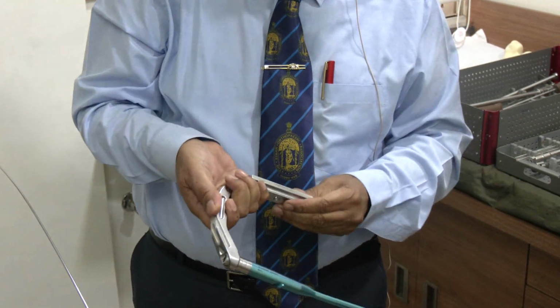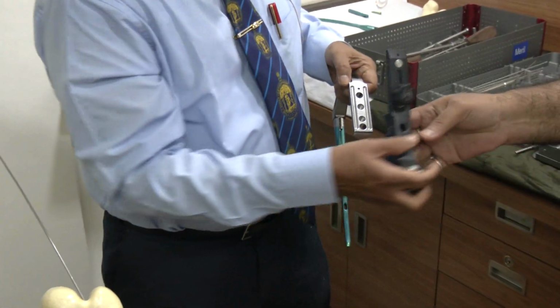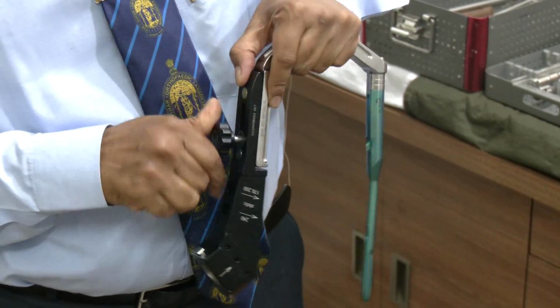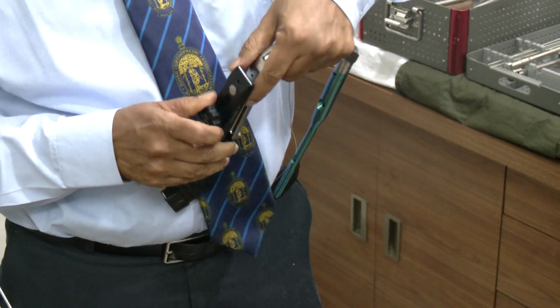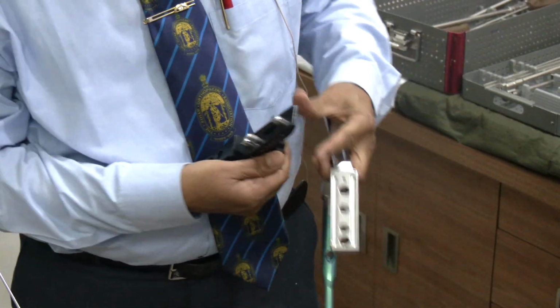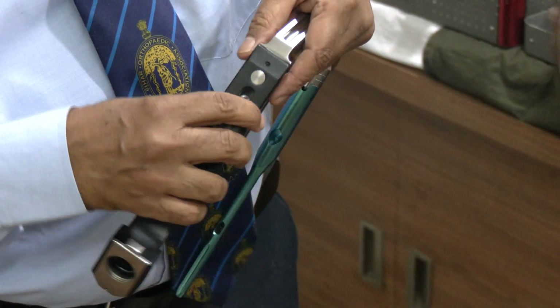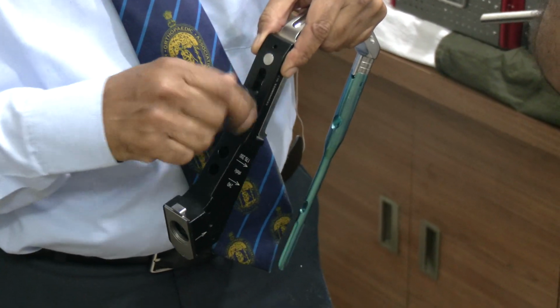That's one. Now I will attach the jig also, the proximal locking jig. The proximal locking jig has a nut and turnbuckle. There are two stubs so that it fits properly. So I'll show those stubs also. There are two holes in the jig which fit properly, and there is a place for passing a K wire also.